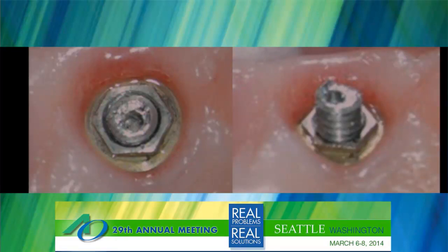That can become a problem if the screw is so locked in there you can't get it out. You must be concentric, because if you have to take this screw out in pieces, you have to take the whole body of the screw out before you can go after any of the residual threads. You should not introduce a tap into an implant if there's part of the screw body in there, because taps are brittle and taps break. And if you try to introduce a tap with too much interference in there, it can cause you major grief.